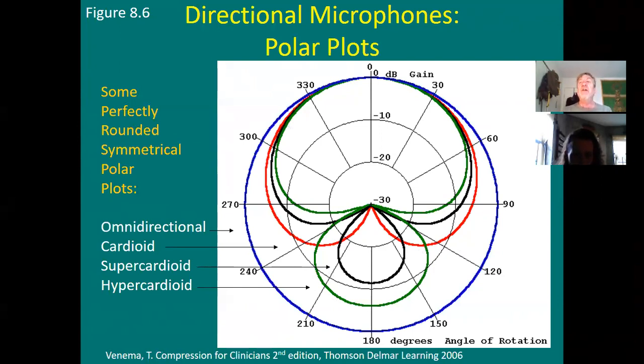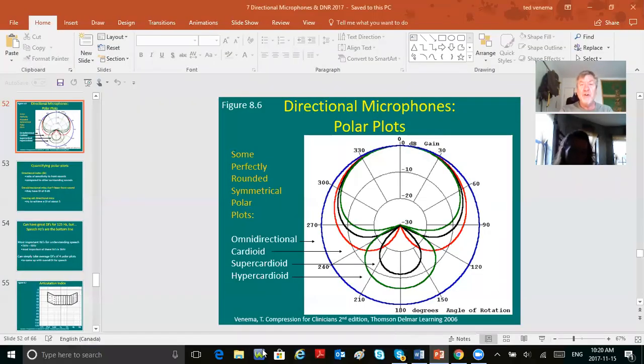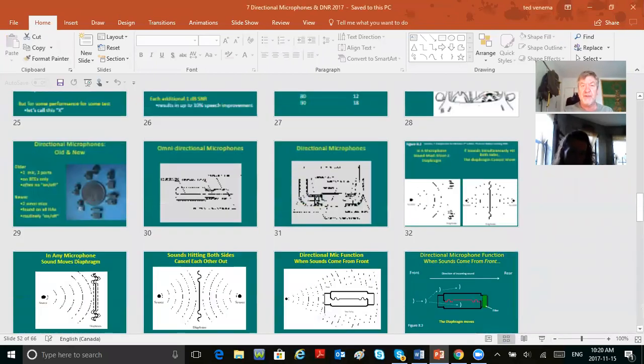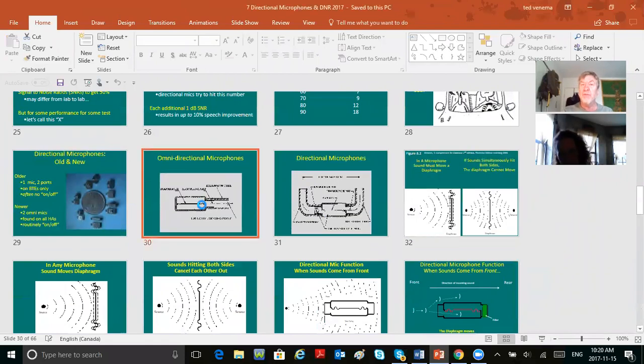It's going to help you hear better in noise. Hopefully, it's assuming that the speech is coming from in front of you and the noise is coming from the sides, okay? If the background noise is coming from all around, the directional microphone is going to be less sensitive to sounds from the sides and the rear, hopefully thus improving the signal-to-noise ratio, because it's now like a tunnel. It's focusing on sound from the front. It's a very good question to ask, and I'm very glad people do ask it. We're going to reinforce that next time, but let's look at how they work.